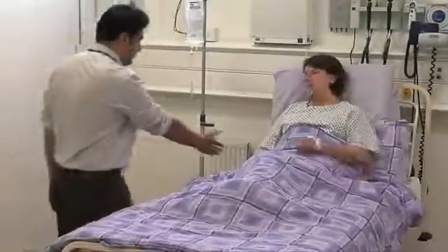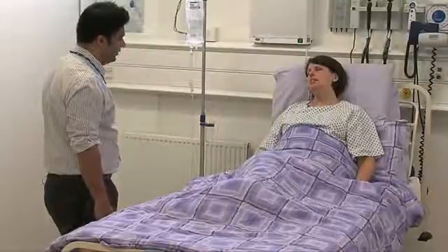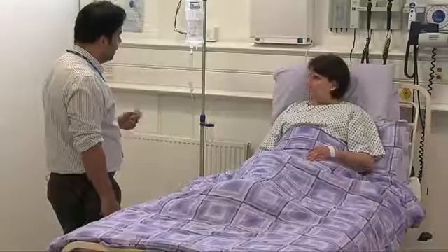Hello there. Oh, hiya. My name's Tahir Kwayum. Can I ask you your name and your date of birth, please? Yeah, it's Kirsty McNair, 29/9/65. That's fine. I hear you're having some difficulty in emptying your bladder. Oh, it's terrible. One of the ways that we can help you is if we insert a catheter into your bladder. Right, what's a catheter?